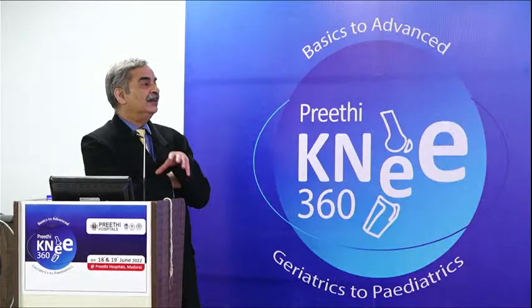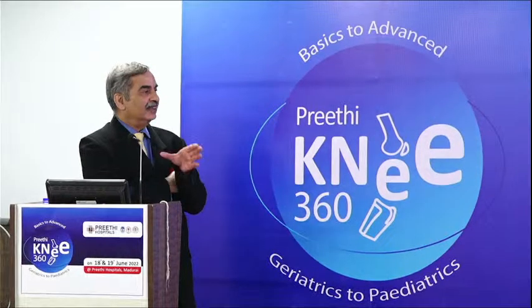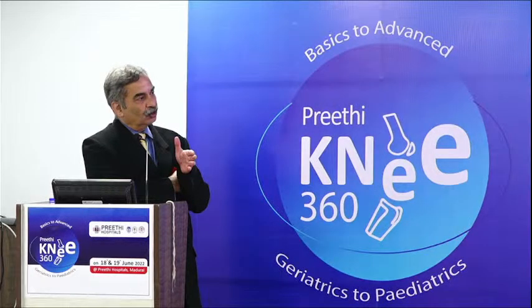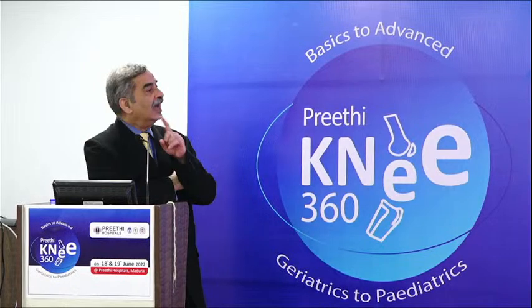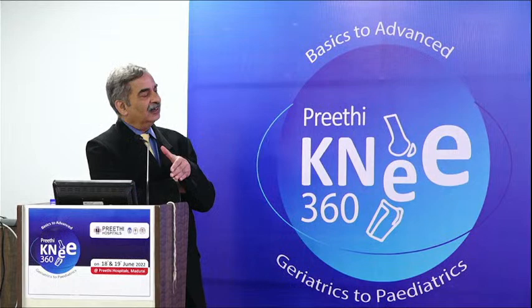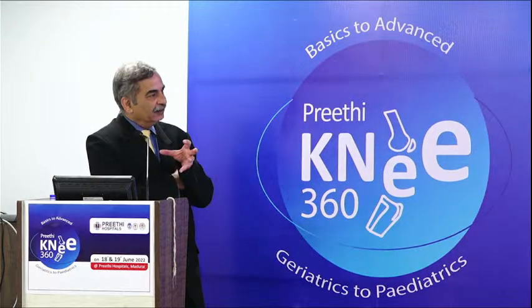So I decided that if I give up the thought of giving a knee on that side, debride, and put an Ilizarov, he will be able to put weight on it immediately. So that was the single purpose. When I did this debridement and Ilizarov, I got him out of bed the very next day, putting full weight because of the Ilizarov, and eventually it healed. Then I took time to debride the other left side, put in a spacer, and when everything became alright, I went in and did a knee.